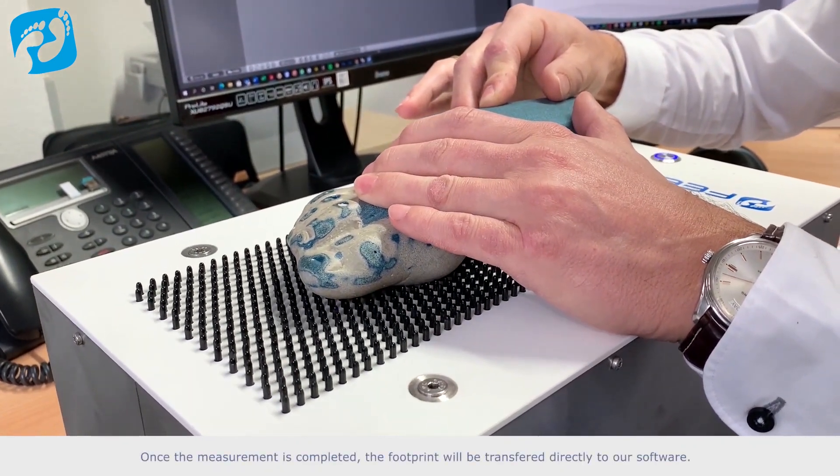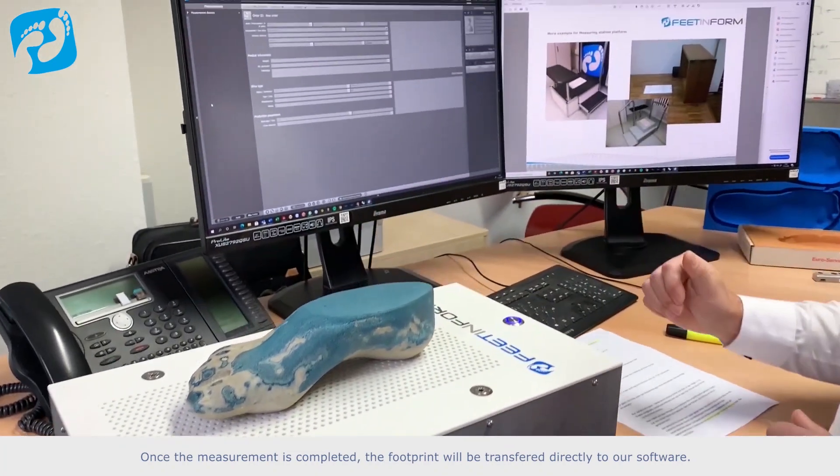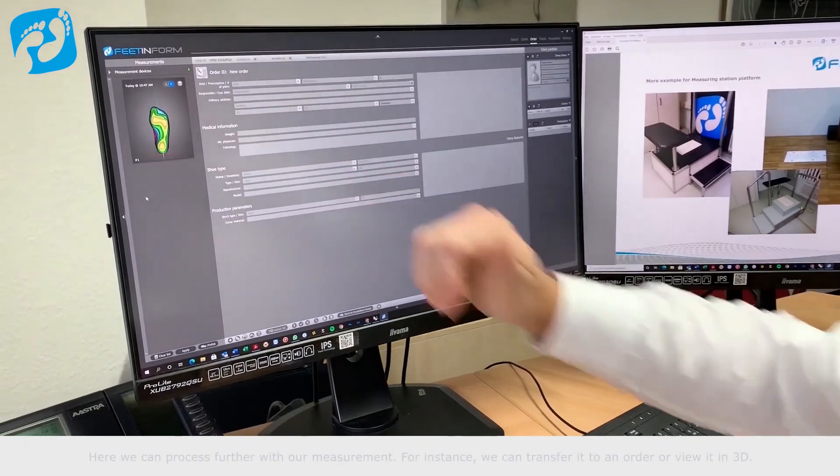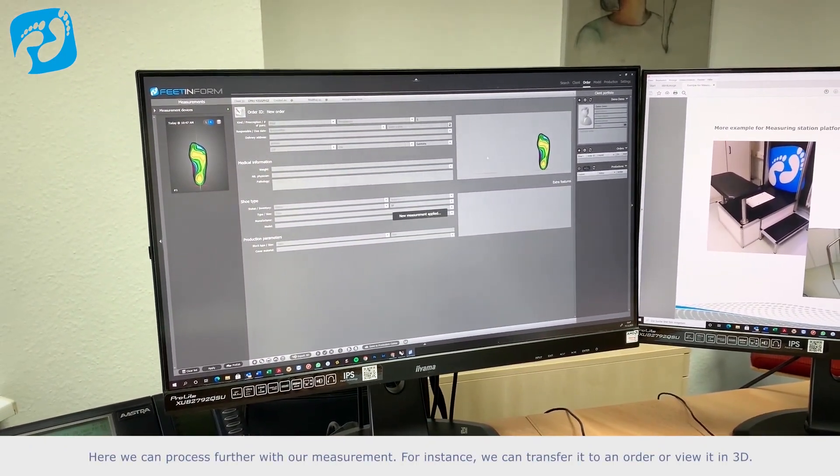Once the measurement is completed, the footprint will be transferred directly to our software. Here we can process further with our measurement — for instance, we can transfer it into an order or view it in 3D.